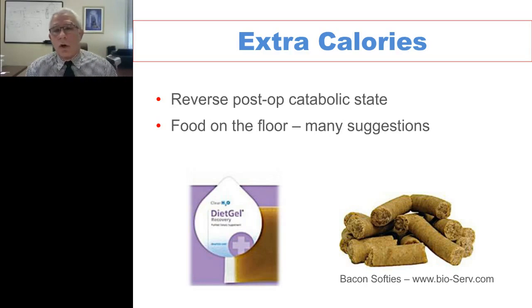Of course, we cover the animals very well with good analgesic protocols pre-op and even post-op, but we used gas anesthesia, isoflurane. These animals were immediately post-op after closure. We placed them in the recovery cage, of course, with a heating blanket underneath and all that. So we like to practice what we preach.